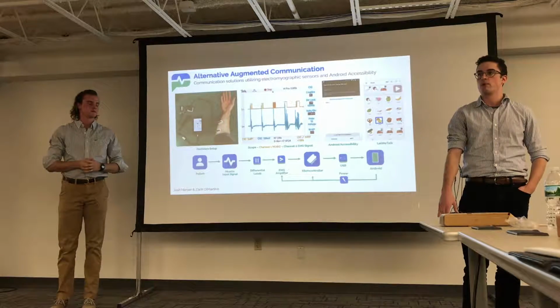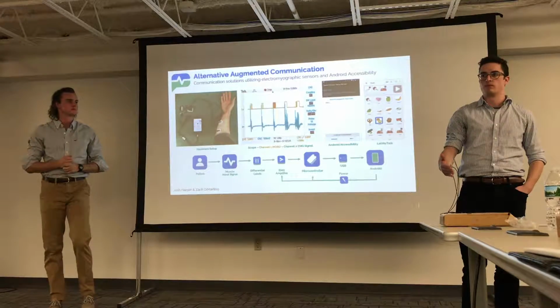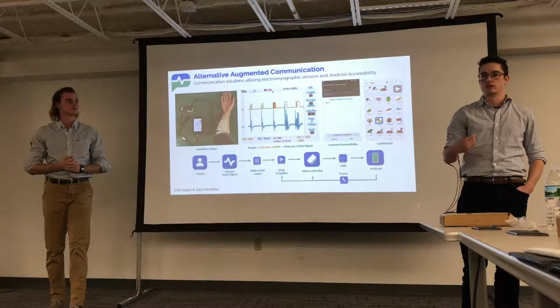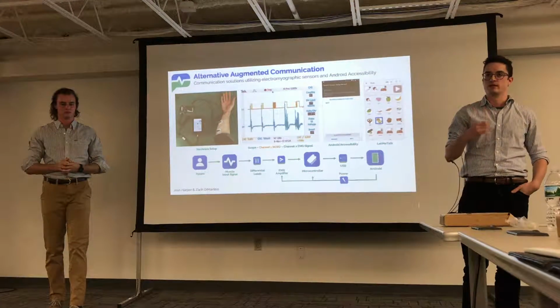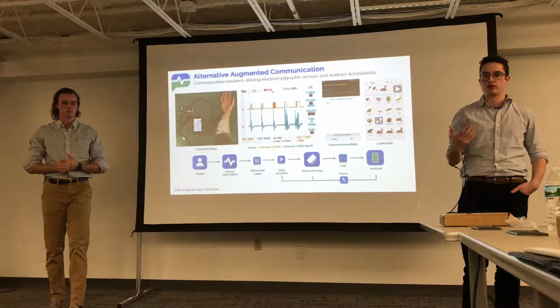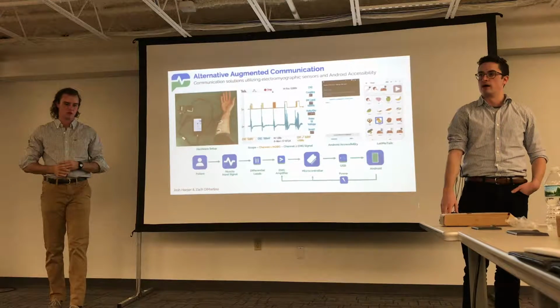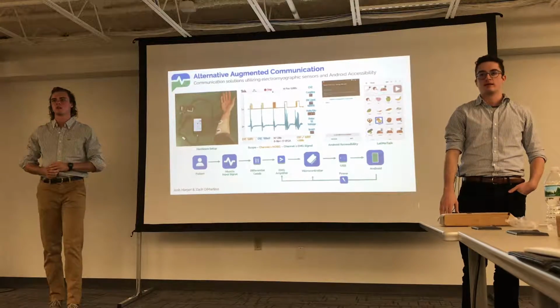Yes, there are products out there that allow people who have disabilities to use different things, for example, people with complete motor impairment. They can use a sip and puff method using a mouthpiece that allows them to control, say, a wheelchair and other devices. That could possibly be hooked up to an Android device and be used in tandem with it. But those devices are very, very expensive. But there's no existing device using EMG to do this.